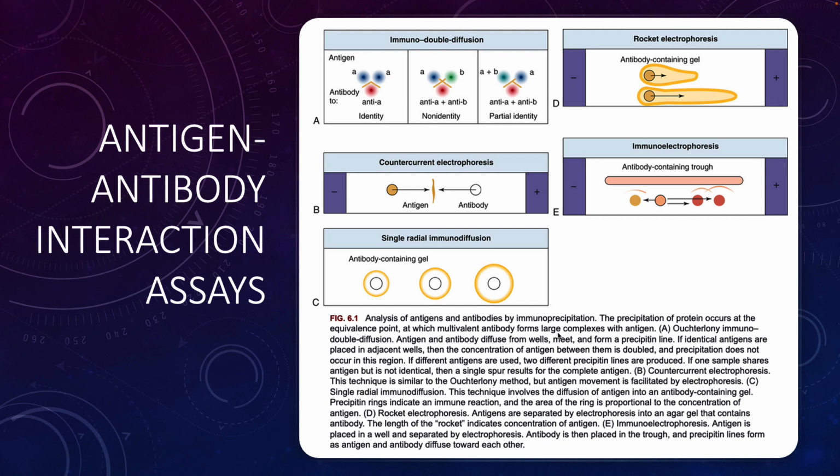I'm not going to explain all of these different tools, and because I'm not explaining them in a lot of detail, I'm not going to expect you to know a ton about them either. But I do recommend you read these sections in the textbook or you look up these different types of assays because they may be very important for you who are going into clinical fields. So you have a number of assays you can do in a laboratory setting that are antigen-antibody interactions.